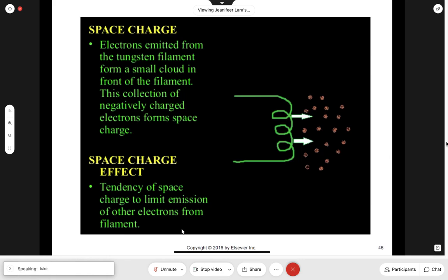Thermionic emission. So if I say thermionic emission from now on, for the rest of the 2 years, y'all will know what I'm talking about. And where do I find thermionic emission, Julie? What part of the tube is that happening in? The cathode. I love it. What sizes of filaments are there, Marisela? Small and large. Perfect. And what are they made up of?